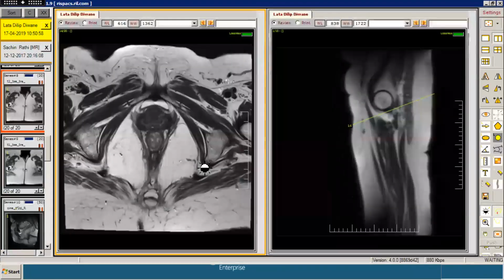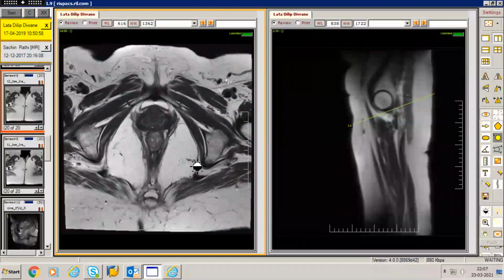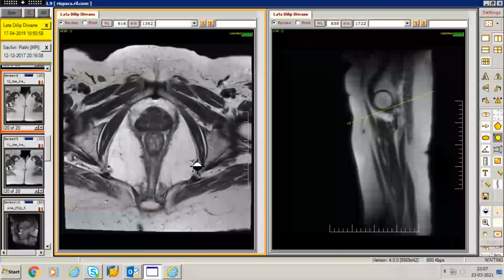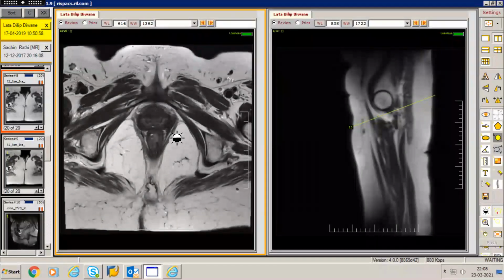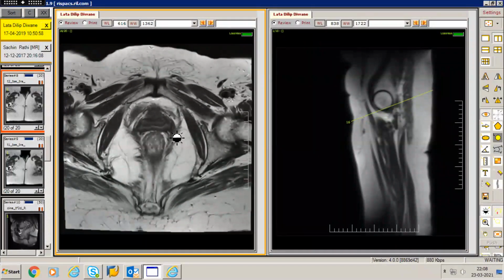So you can just show them. Okay, you can show this image. No, just put that image there. Yeah, just go up. Okay, so just come back up again. Next image. Yeah, sorry, next image, the one below. That's it, stop it there. So this is the bladder, right? If I'm correct. Now keep on going up. That's a bladder, right? Yeah. Okay, now just come down again.